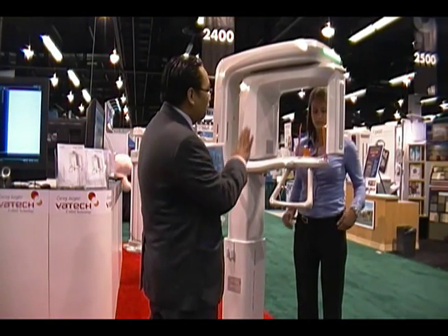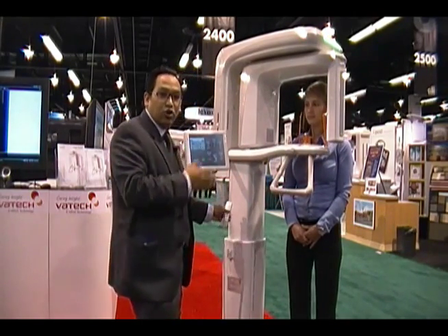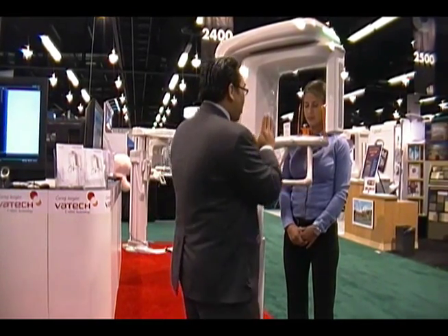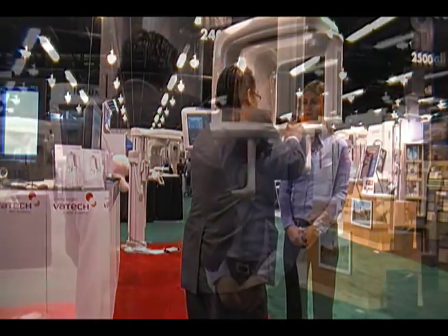Unlike your traditional panorex where you have a mirror system — where the patient is looking into the mirror and your staff member is standing on the side trying to adjust the laser light for positioning — with our device, we do front loading. Because it's front loading, the staff member now has a direct frontal view of the patient, so we can line her up correctly.